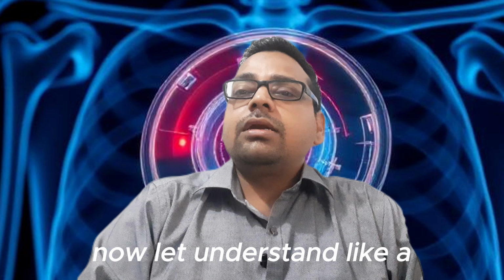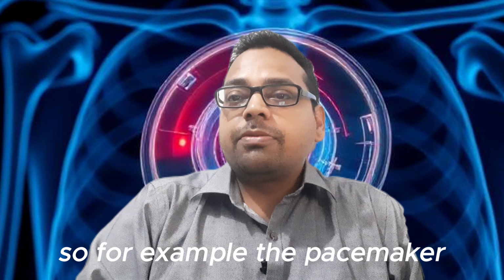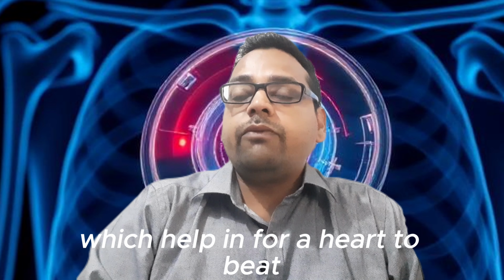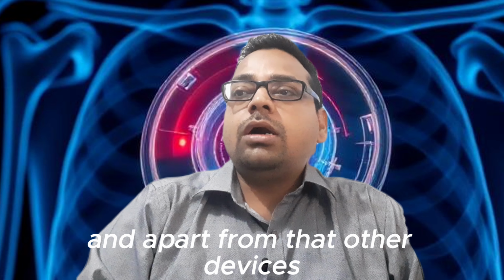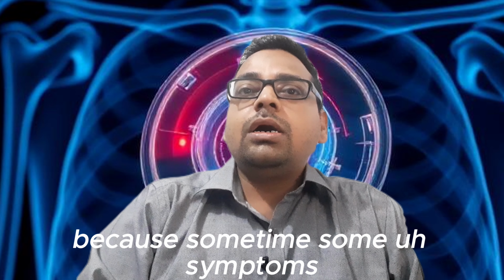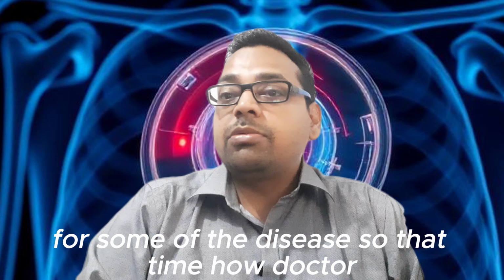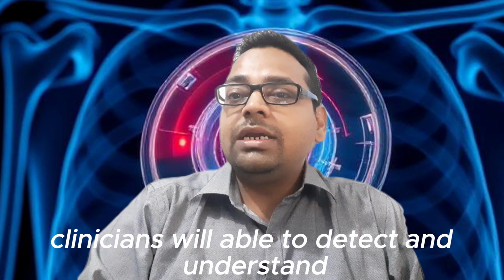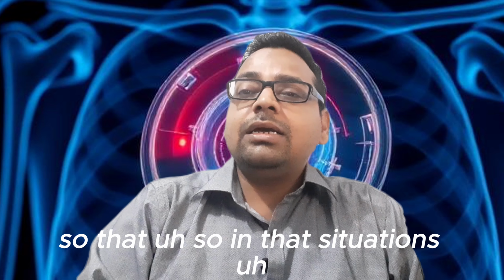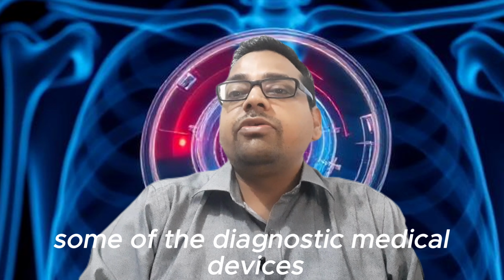Now let's understand some examples of active implantable medical devices. Pacemakers are one of the active implantable medical devices, which help the heart to beat. Apart from that, there are devices used for diagnosis, because some symptoms may appear for a while but not all the time, for some diseases. So how will doctors or clinicians detect and understand the patient's condition and symptoms? In those situations, clinicians or doctors implant diagnostic medical devices.